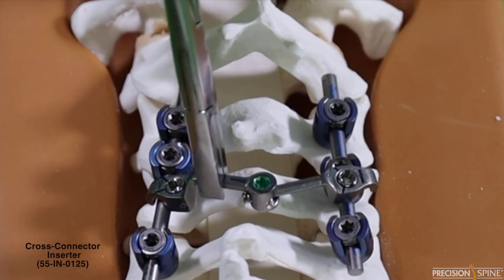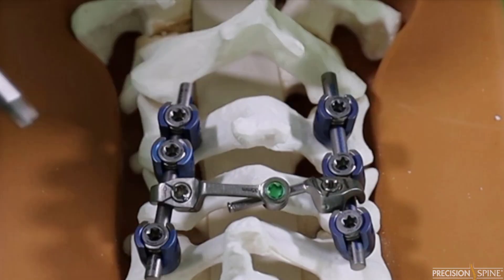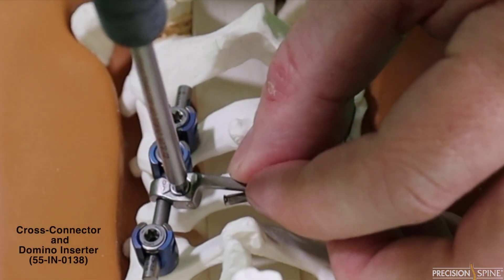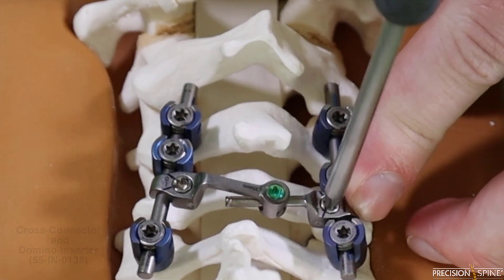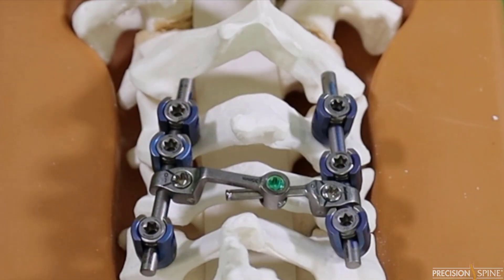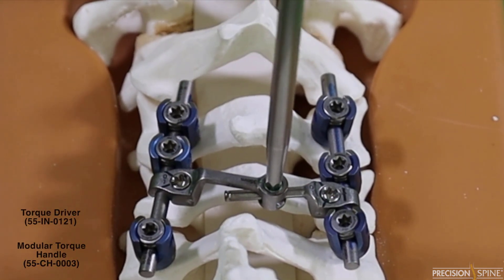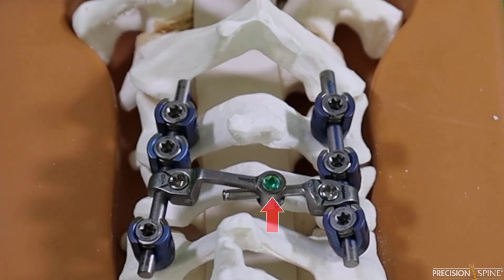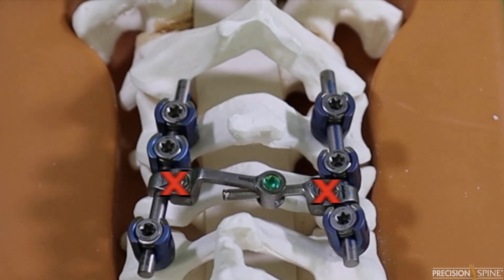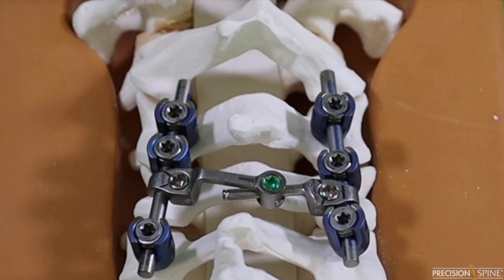The rod-to-rod connector is attached by fully seating each hook on the rod. Rotate the cross connector inserter 90 degrees clockwise to fully engage the cross connector cam to the rod. Final tighten the midline cap screw by rotating the torque driver until the torque limit of the modular torque handle is reached. Only the midline cap needs to be final tightened — do not final tighten the two lateral caps. The cam mechanism is fully locked when the cap has been rotated to the lock position.